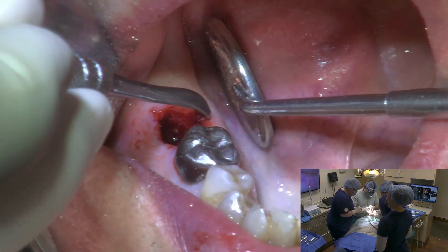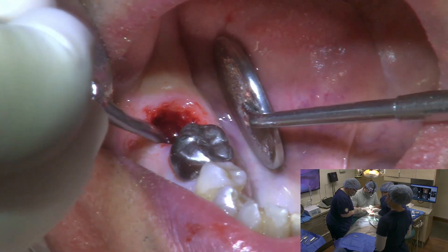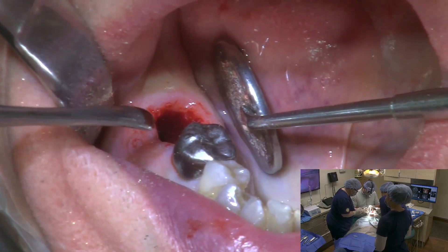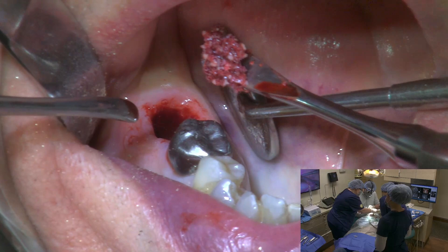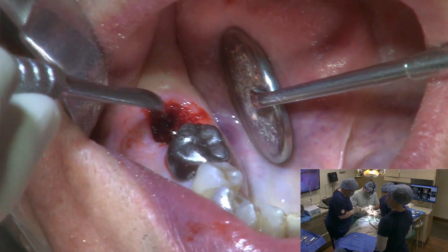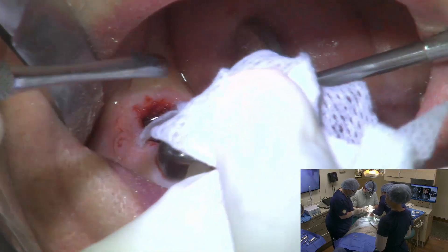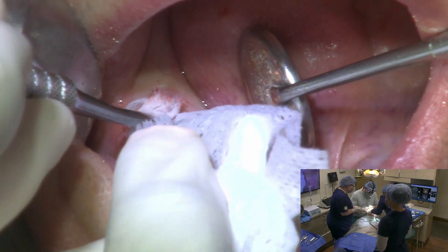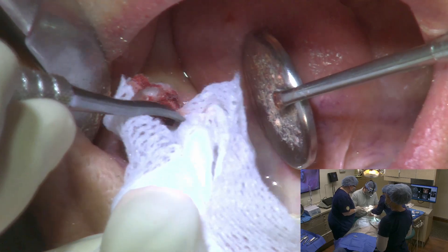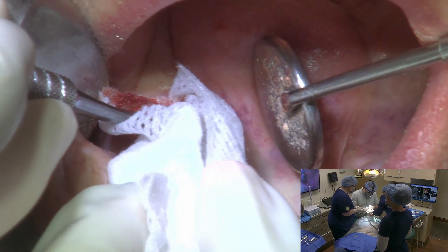We're going to use a 50/50 mix of a cortical/cancellous mineralized bone graft, and we're going to push that down in there. It's got mixed with platelet-rich plasma that we drew prior to starting the procedure.